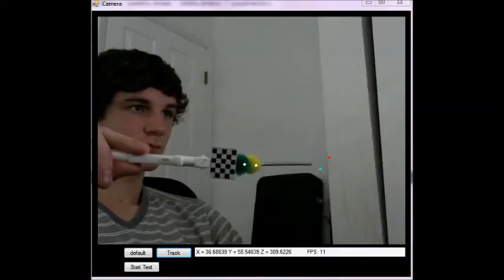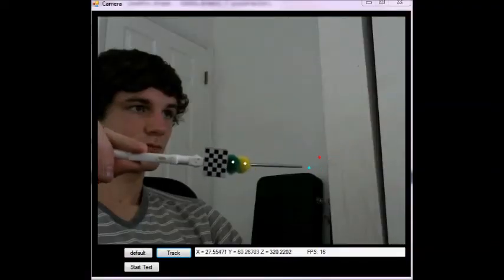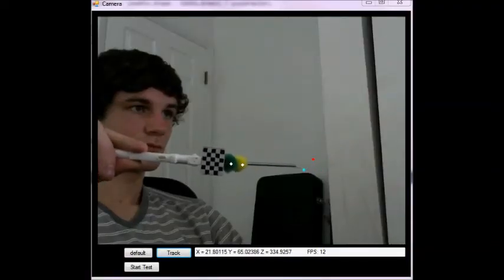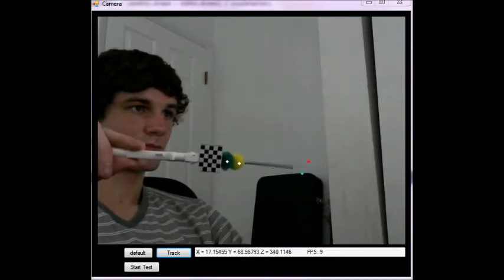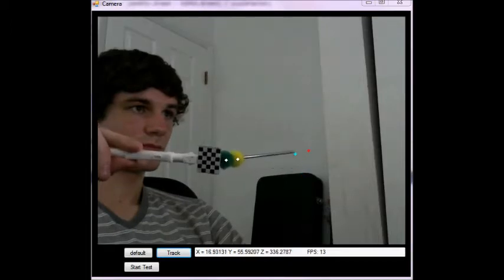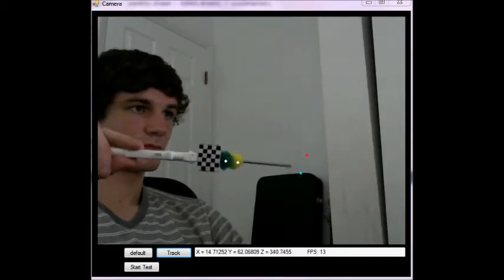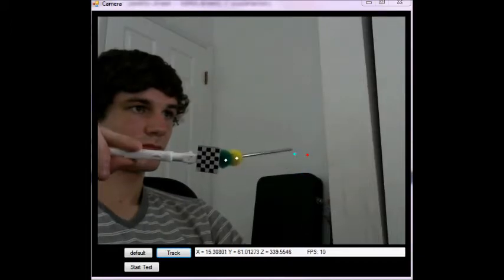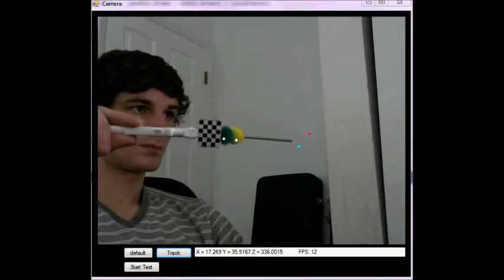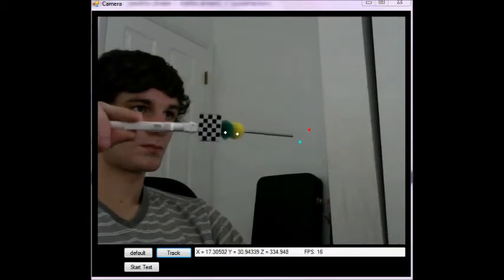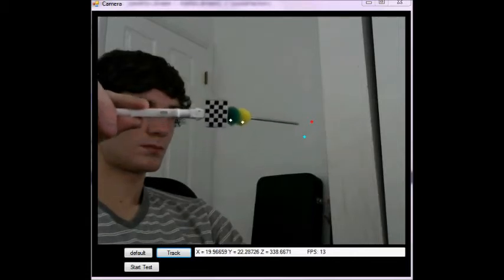The white dots superimposed on the image are the prediction of the center of the spheres. The red dot is the prediction taken from the checkerboard as demonstrated in the first video, and the blue dot is the prediction of the tip taken from the spheres.